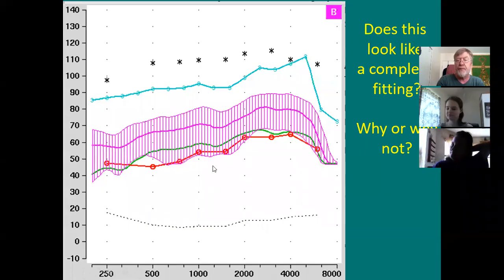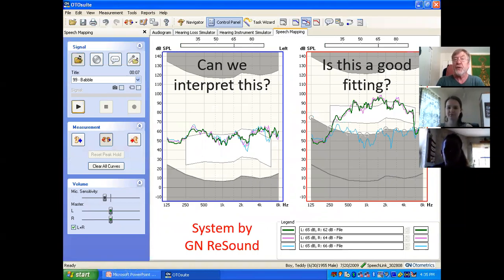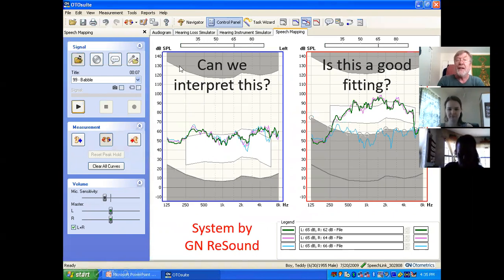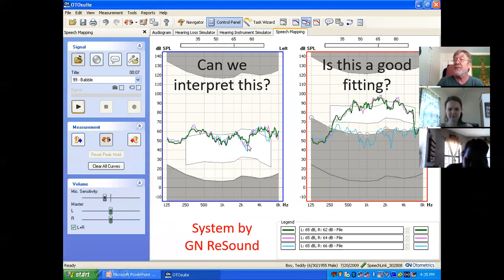This essentially sums up where we are regarding today's real ear. Here's another real ear system called the Oracle — OTC has an Oracle system. You can see the dynamic range, here's MAP, normal hearing, and loudness tolerance levels on the top. You can see the speech banana where you'd want speech to be — it's in the lower third. This is for someone with completely normal hearing; there's no hearing loss.